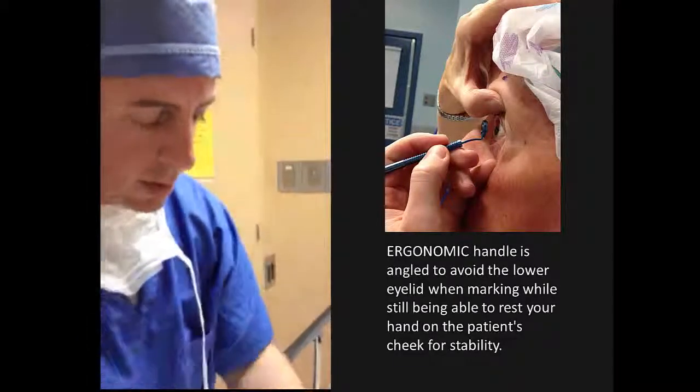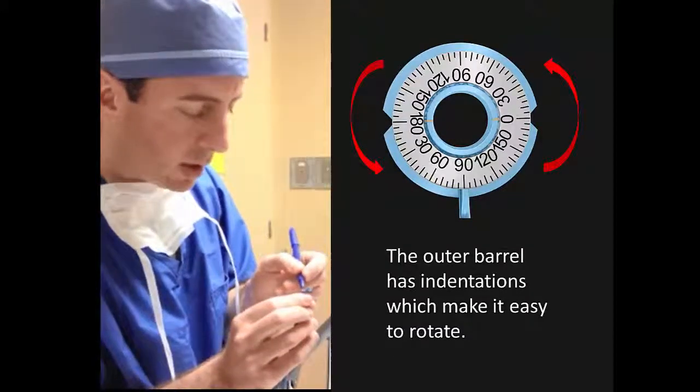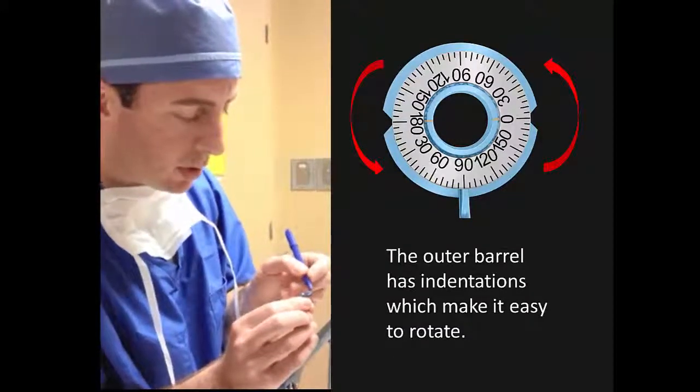So on this one, we've already set it up to mark at the 90-degree axis. I put a little bit of ink on the marker.